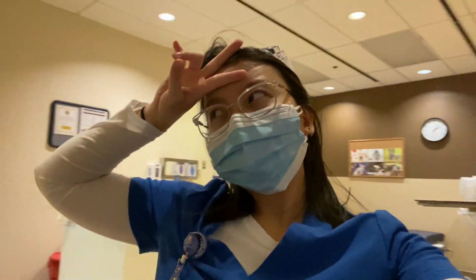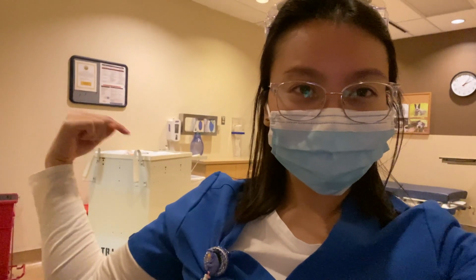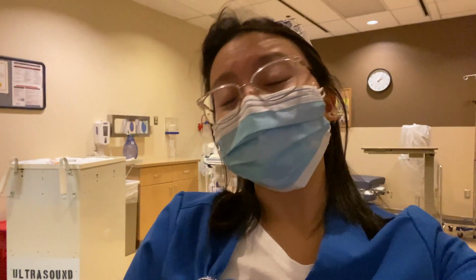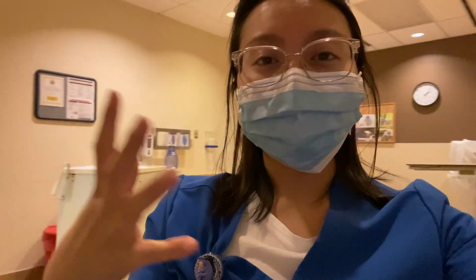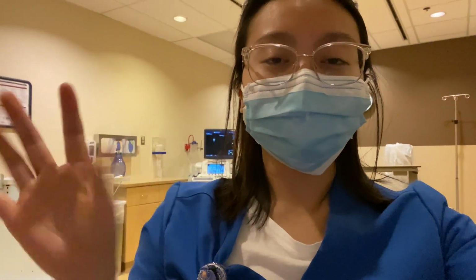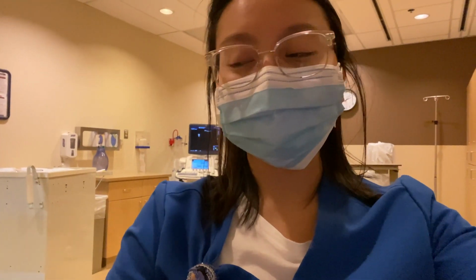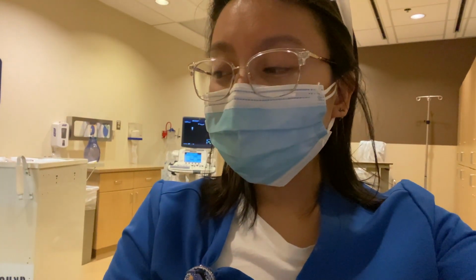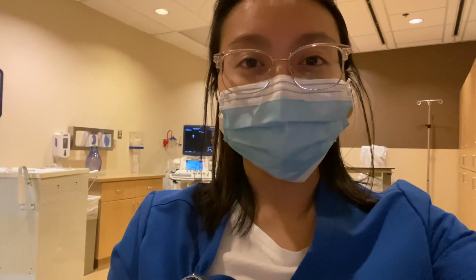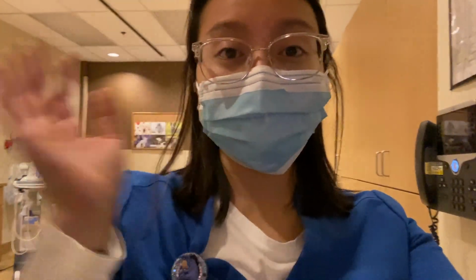So it's currently 2:06 and I'm waiting for transport to bring down my thoracentesis. Look, I have everything ready on the tray here, and I'm just patiently waiting for my patient. It's a therapeutic exam, so basically what will happen is once I remove the fluid, the doctor just goes to their reading room again, and then I call transport to come back to get the patient. They're gonna get a chest x-ray to make sure everything was okay after the thoracentesis, and I get to throw away the fluid because it's therapeutic. They're not gonna run any tests on it. If a procedure is for therapeutic purposes, we just throw the fluid away.